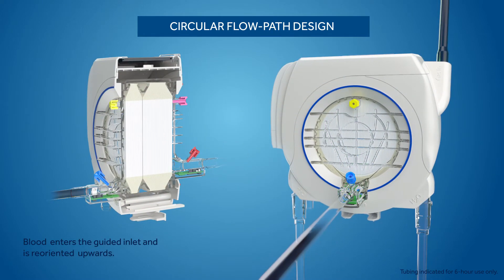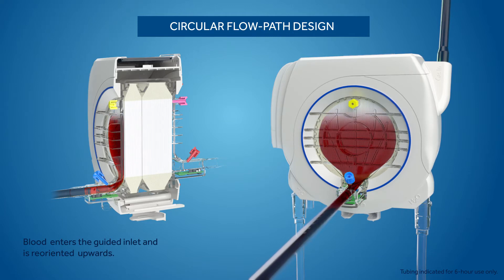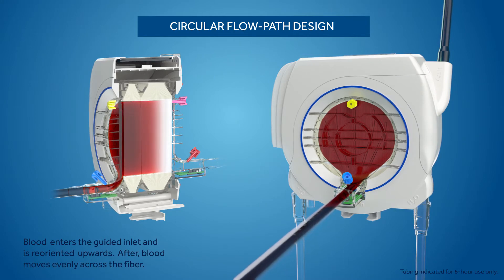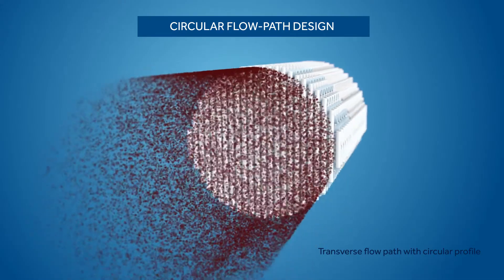The circular shape, guided inlet design, and filling vanes work in combination to create the Nautilus Smart ECMO module's circular flow path design. This flow path technology results in improved gas transfer.